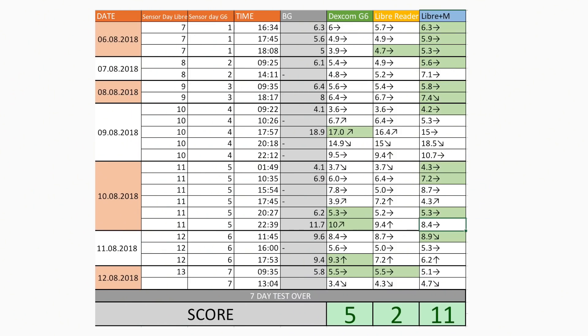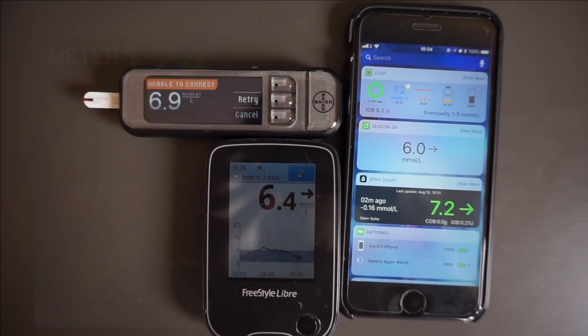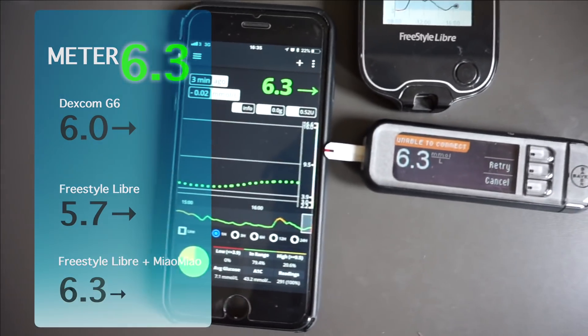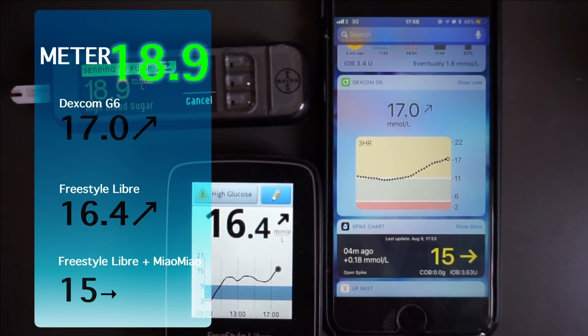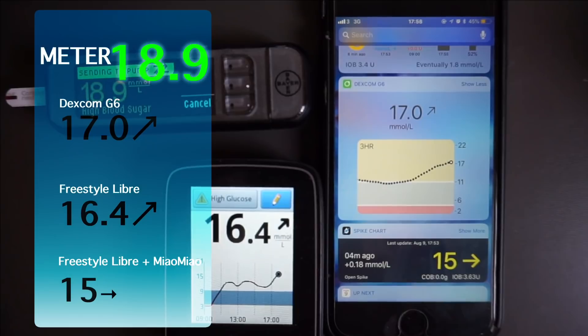Comparing with the third-party Miaomiao and Spike data: Spike is outperforming both the Freestyle Libre and the G6. I calibrated Spike twice on day one of my Libre sensor. This isn't surprising as I fully trust the Spike and Miaomiao combo — it's why I'm looping. One key difference is that Spike readings tend to be more accurate in range but less accurate when high or low, and they feel more delayed when glucose changes rapidly.